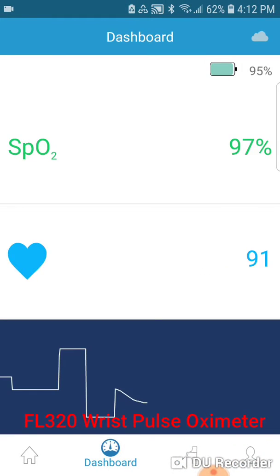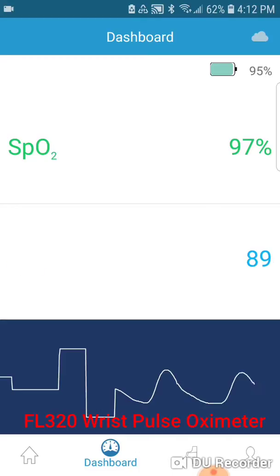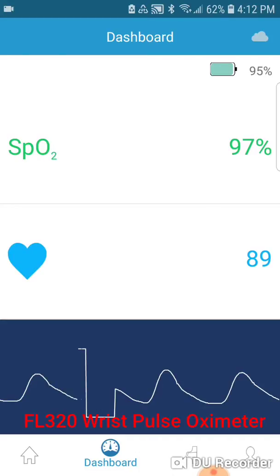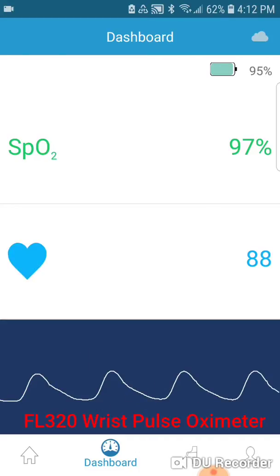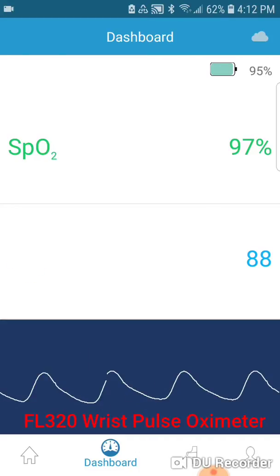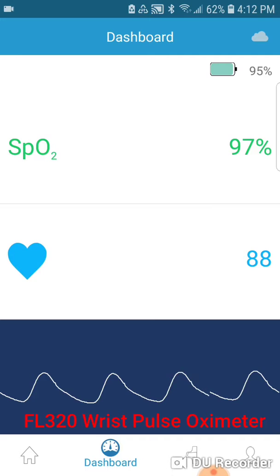The app also carries the dashboard option, which will give you a real-time view of your SPO2 and heart rate level.